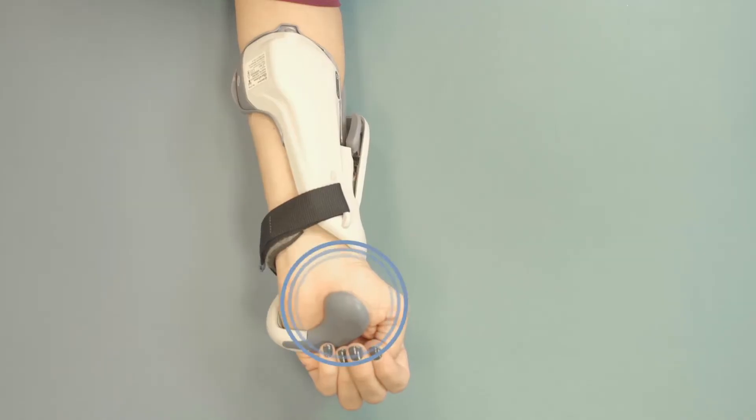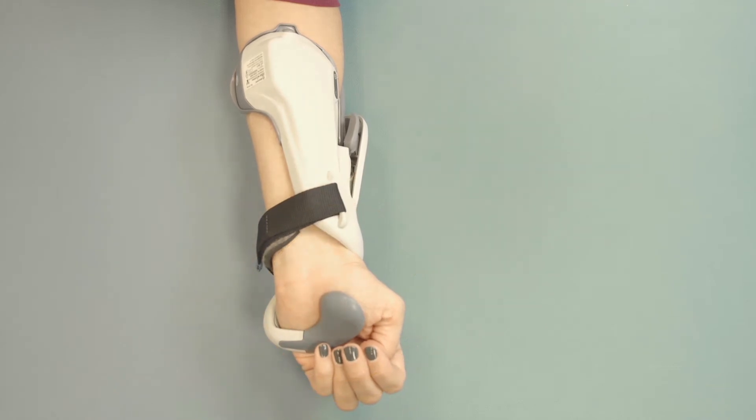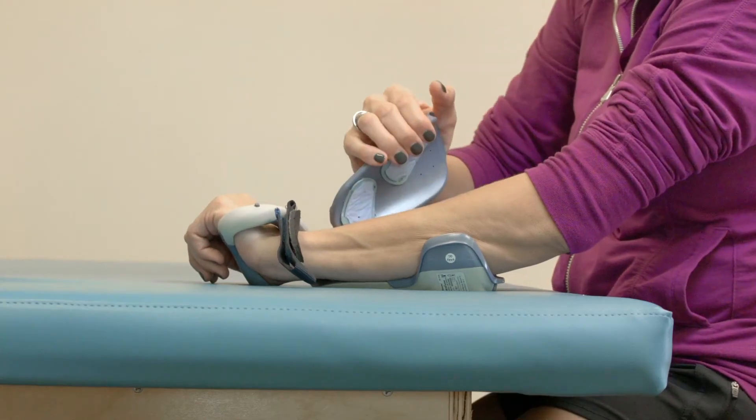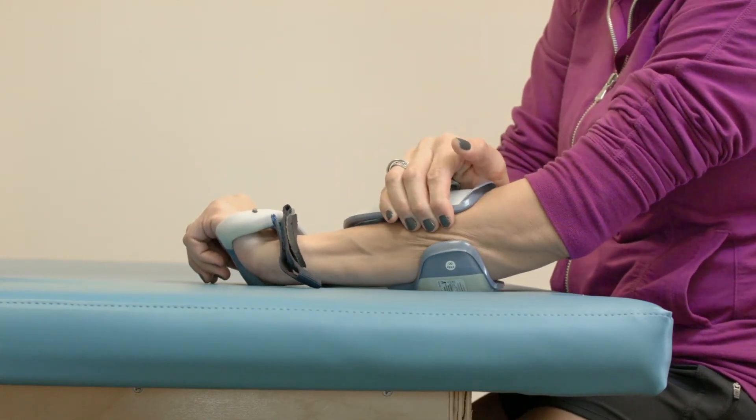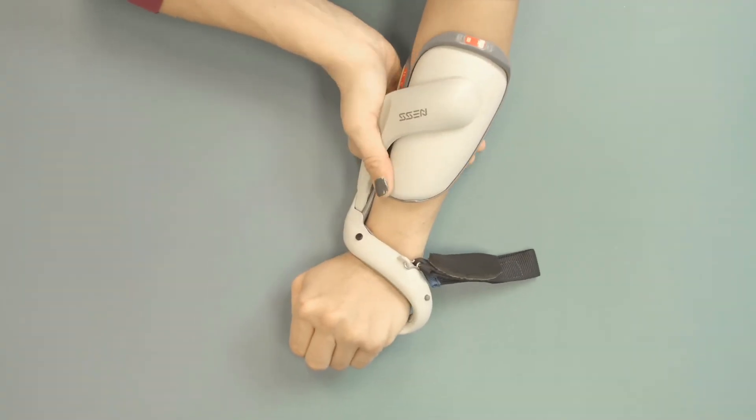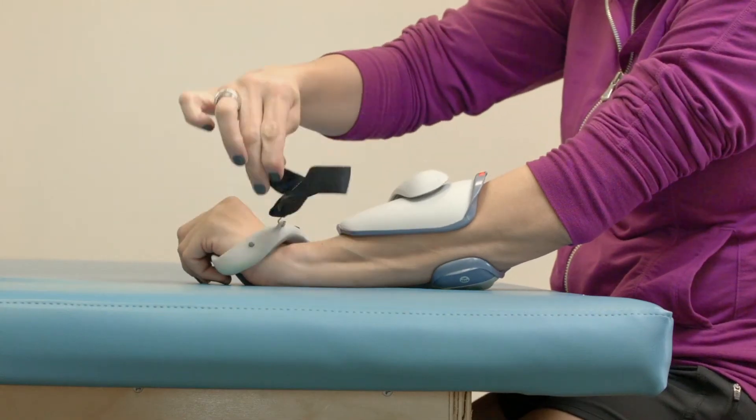Make sure the thenar electrode is at the base of your thumb at this point like so. Close the extensor wing and give it one final squeeze so that it's snug. Finally, fasten the wrist strap if appropriate.